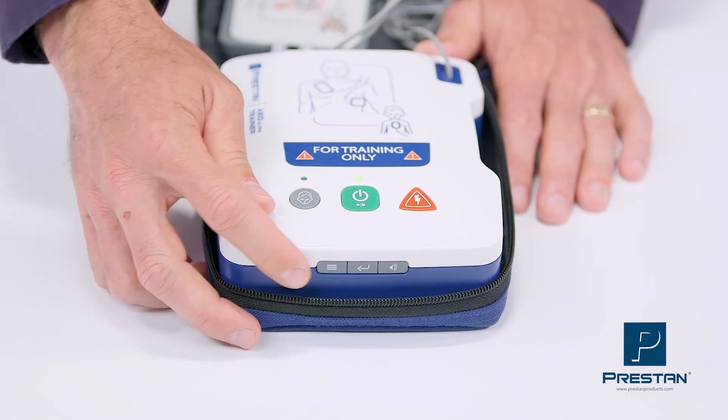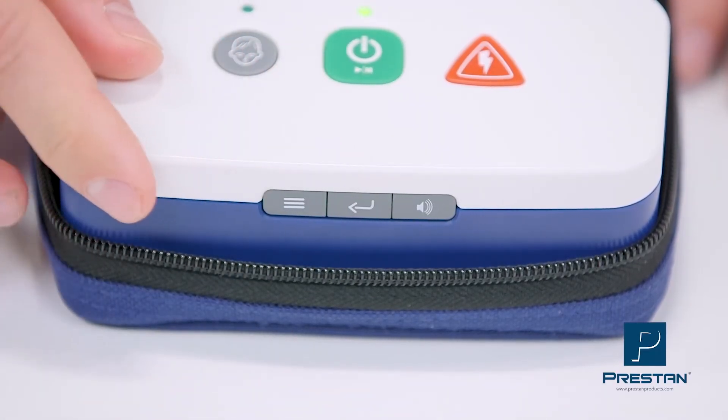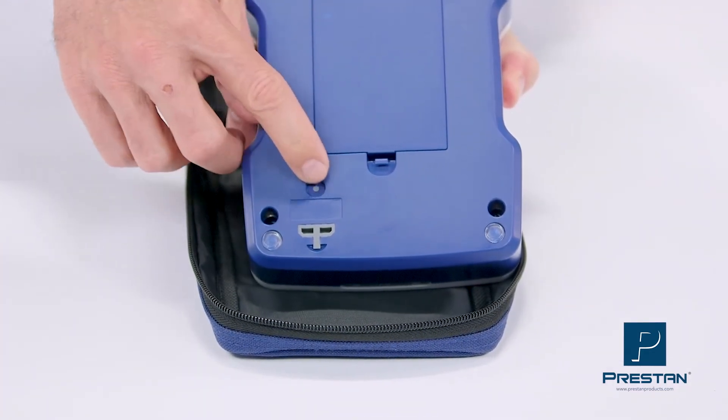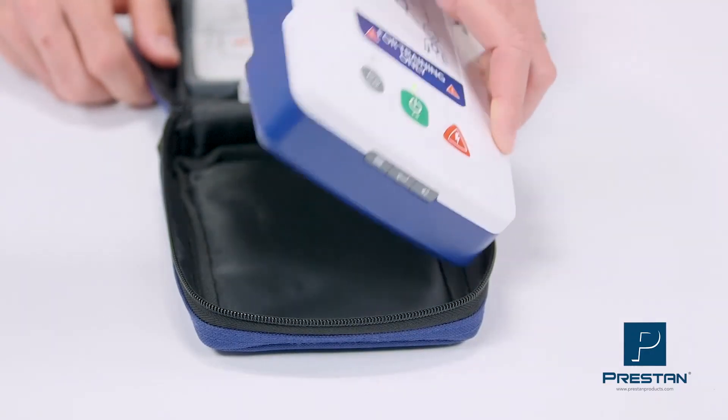There is also the ability to turn on or off the compression metronome and ventilation command, easily switch languages — including Spanish and English — and update software when the guidelines change.